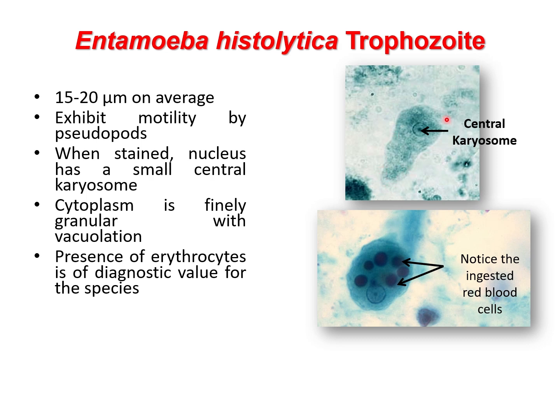So first of all, you can notice that these trophozoites do not have a regular shape. The irregular shape that we see is really due to the emission of pseudopods, which are the false feet the parasite uses to creep over the intestinal mucosa. Another characteristic is that their nucleus contains a very well-defined central karyosome, which is a condensed chromatin that is located at the center of the nucleus. As for the cytoplasm, it is usually finely granular and can present some vacuolation at certain instances.